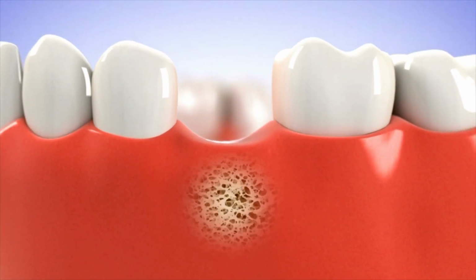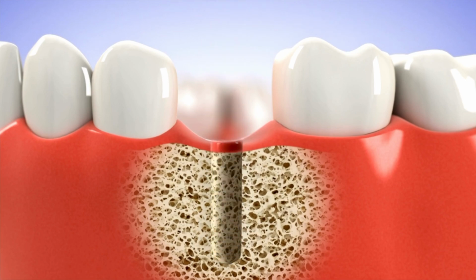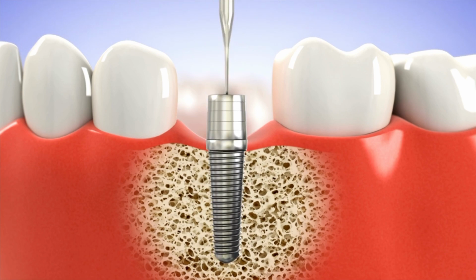And the way I describe an implant is it is a titanium root. It functions as the root for a future tooth. It's completely encased in the bone, and the process by which it heals is called osseointegration. So the bone actually grows into little micro abrasions on that dental implant and stabilizes it. It's actually a really cool process because it actually integrates that titanium into your bone.